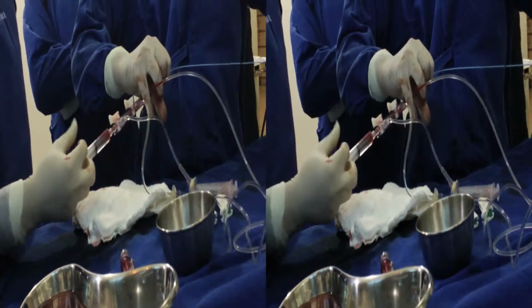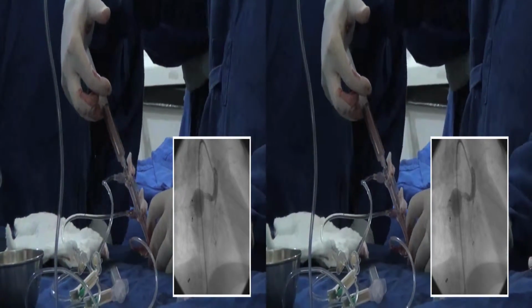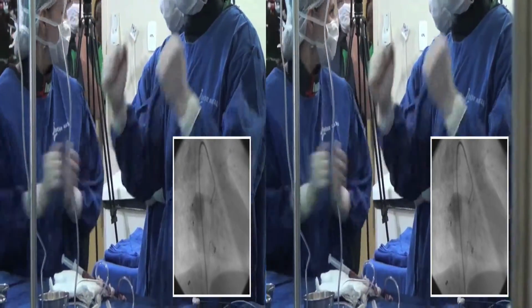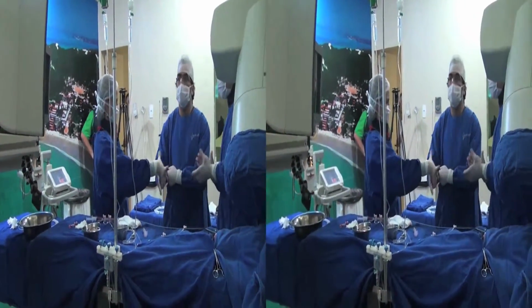We conducted a new injection of contrast to make sure that the fistula is completely occluded, including with a better opacification of the right coronary artery, which can be seen in this still image. We obviously consider the procedure a total success and cure of the patient.